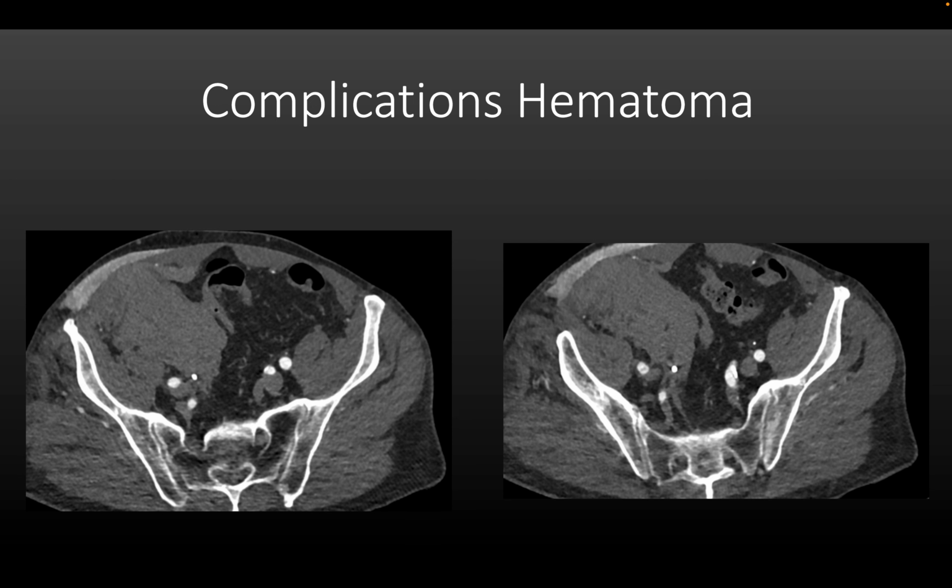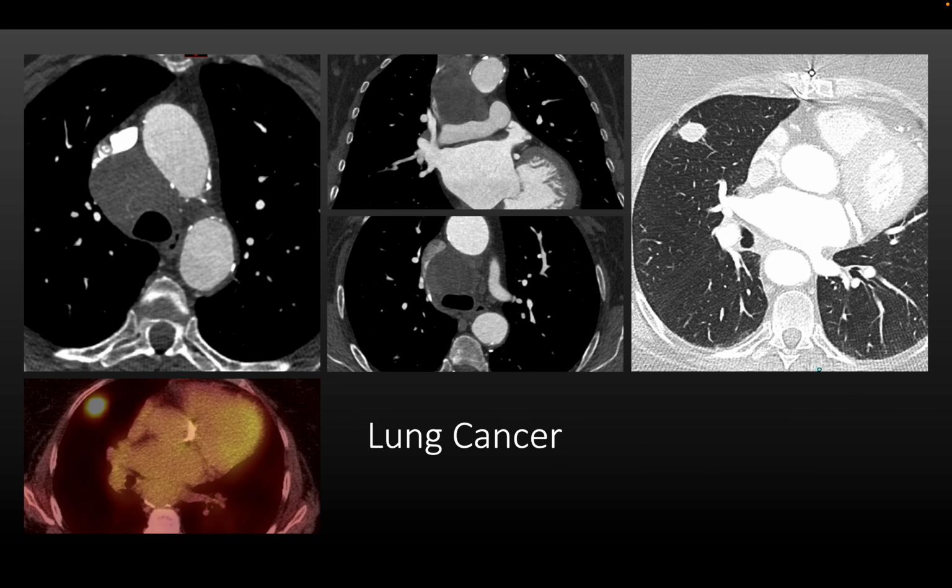Sometimes at the puncture site, so that is in the pelvis, we could see at the puncture site a large retroperitoneal hematoma. I remember we had 1 or 2 cases where active bleeding was detected on CT. The patient was transferred quickly to the cath lab, and they covered the perforation or the dissection with a covered stent.